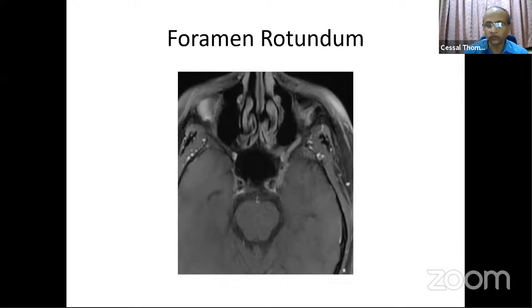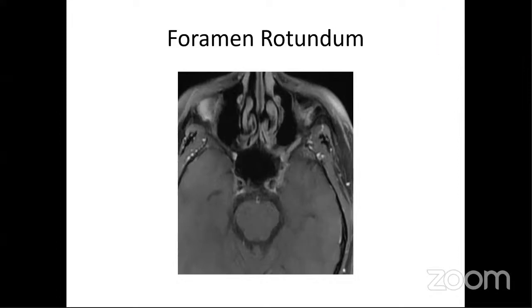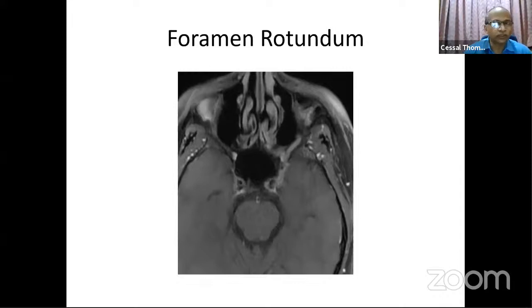So if you know the route of the nerve, you can look for the corresponding spaces and see whether any abnormal enhancement or soft tissue mass is there. And also the lingual nerve; we already discussed the inferior alveolar nerve and lingual nerve, and we reached right up to the skull base. From there the lingual nerve and the inferior alveolar nerve start, and from there again you can trace the mandibular nerve through the foramen ovale to the middle cranial fossa.